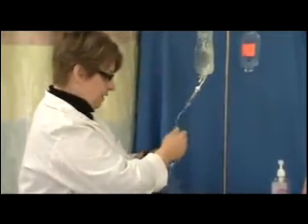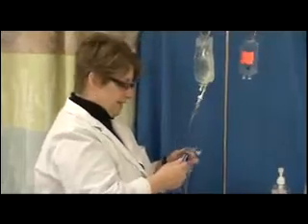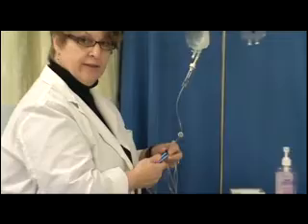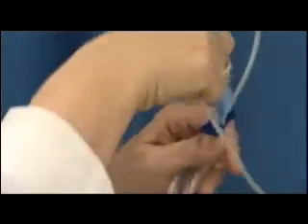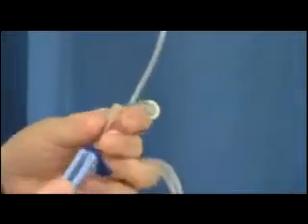So then what you will do, your instructor may show you various ways of inverting these ports so that the air doesn't get in there, and I'm going to leave that up to each individual instructor. For your purposes, in the demo, you want to do it properly. You want to go slow. You want to invert each port as the fluid passes by. Some people loop this around and invert all three at one time. I'm just going to show you how to do it this way.